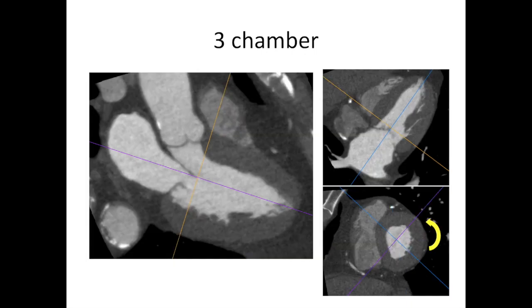The three-chamber view, as the name implies, lets you see three chambers — the left ventricle, the left atrium, and the left ventricular outflow tract. This isn't really a chamber of the heart like an atrium or ventricle, but it's very important so you can see the aortic valve, the aorta, the left ventricular outflow tract, and the association with the mitral valve. This is a very useful image for looking at function and measurements. To get from the two-chamber to the three-chamber, we turn the short-axis view slightly so that the left ventricular outflow tract and aorta come into view.